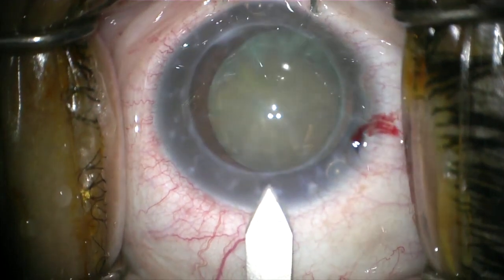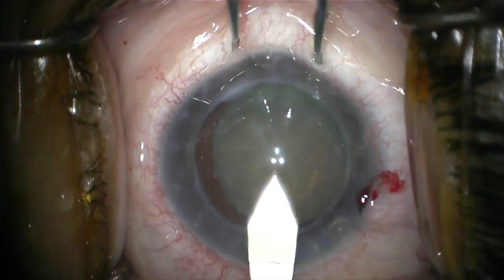The wound construction is also extremely important. You want to make sure to stay away from the edge of the graft.